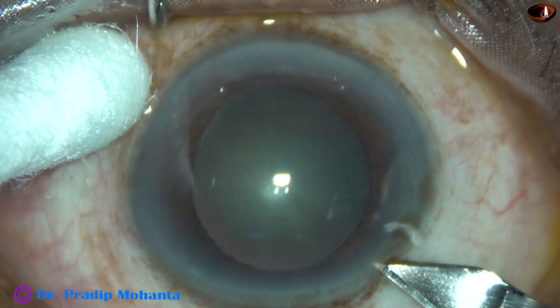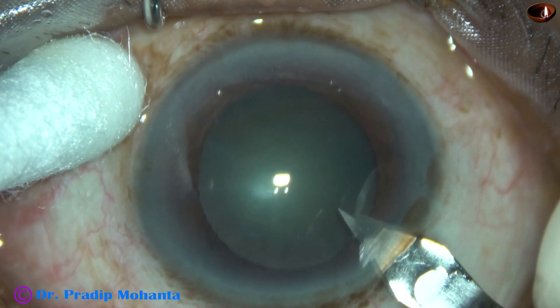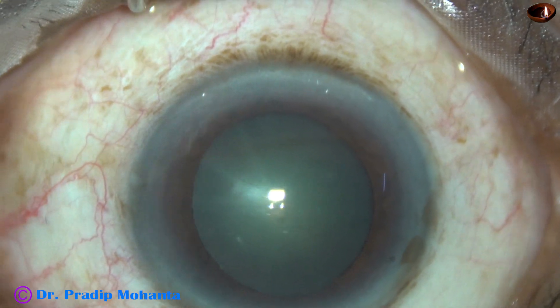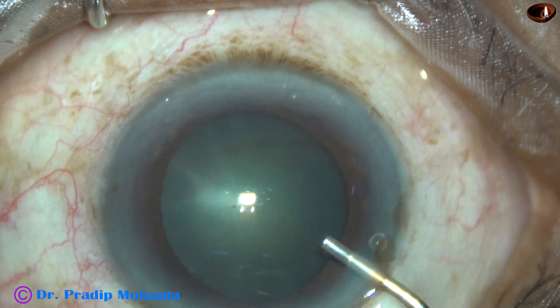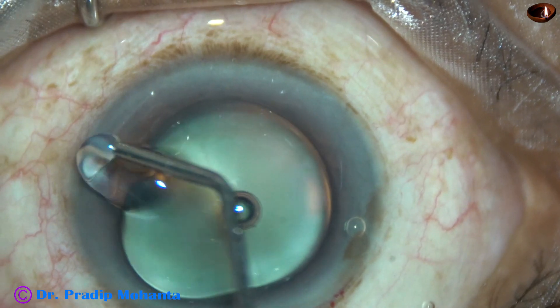In cataract surgery, we should be focused to protect not only the corneal endothelium and posterior capsule, but also the iris. If the iris is floppy, there is a possibility to injure the iris by the chopper. Let us see how we can eliminate this possibility.